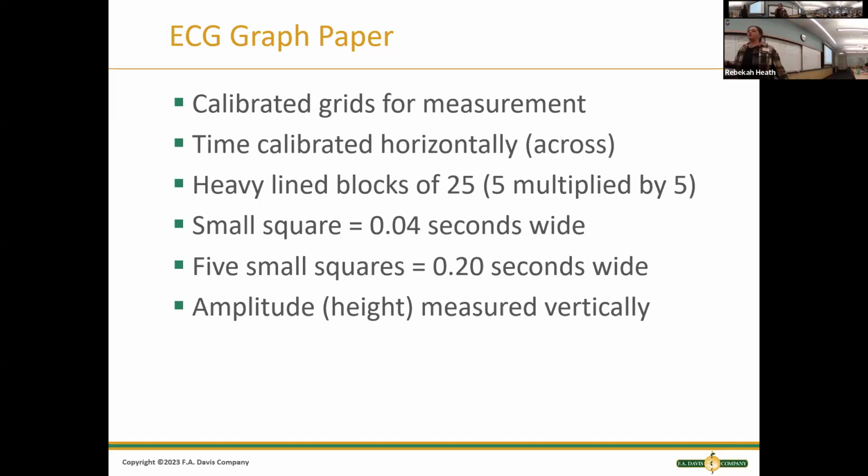Okay. When you look at your strips in the examples that I gave you, most of these are going to be what's called 6-second strips, meaning that if you count up all of these boxes, it should be right about 6 seconds in length.